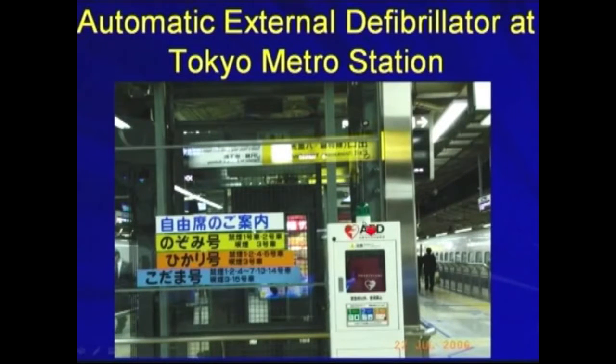The automatic external defibrillator is very useful for patients with ventricular fibrillation, and nowadays in many countries it's quite widely used. Here in a Tokyo Metro station, there's an AED, so that when a patient has a ventricular fibrillation arrest, this can be of use.